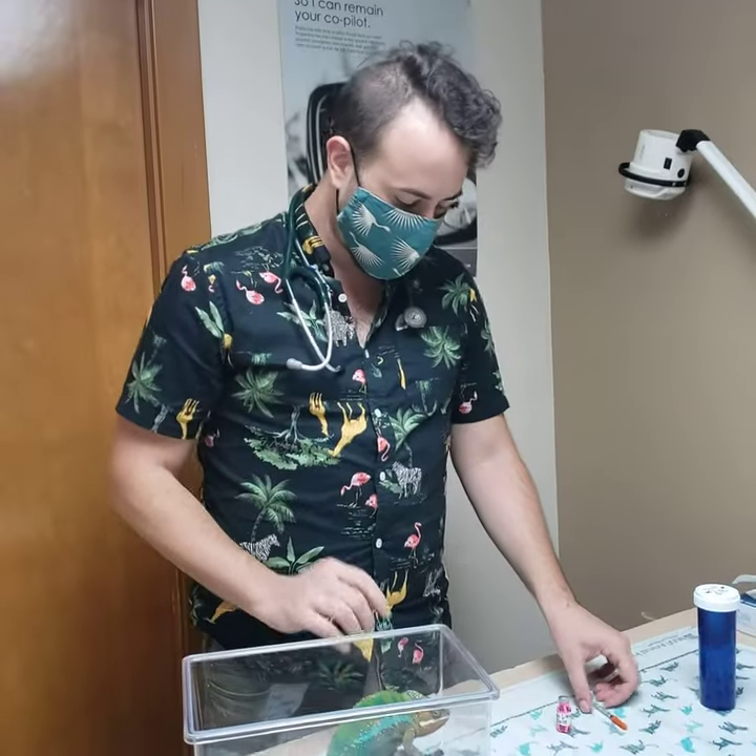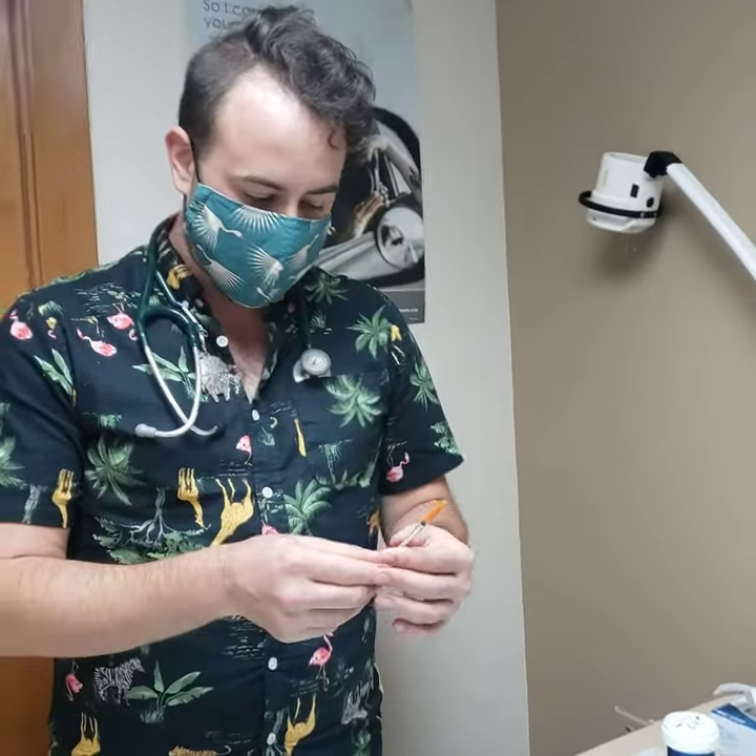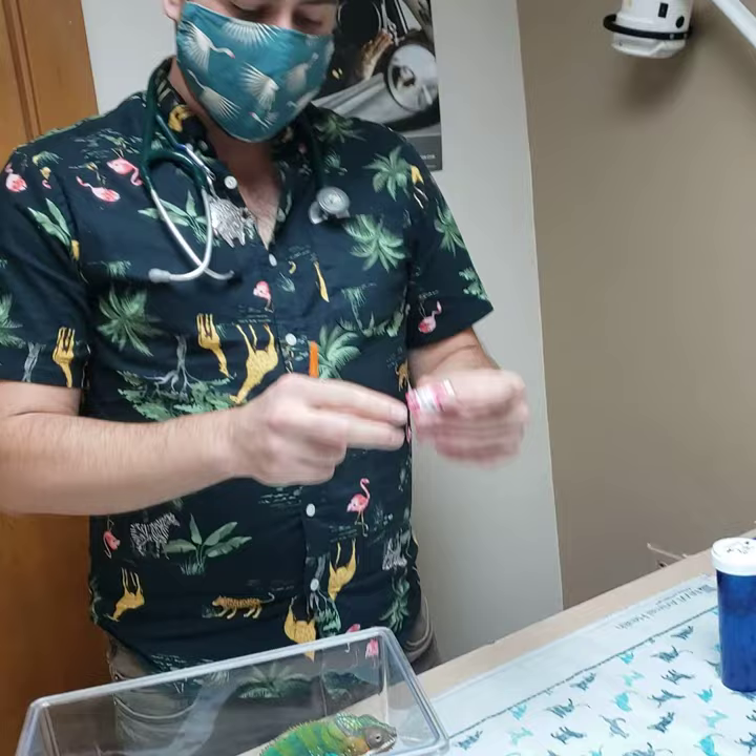So we have our subject here. The first thing we need to do is draw up our medication. In this scenario we are using Fortaz or Ceftazidime, which is an antibiotic. This vial needs to be kept refrigerated at all times, and we're only taking it out of the fridge to thaw or to draw the medication out.